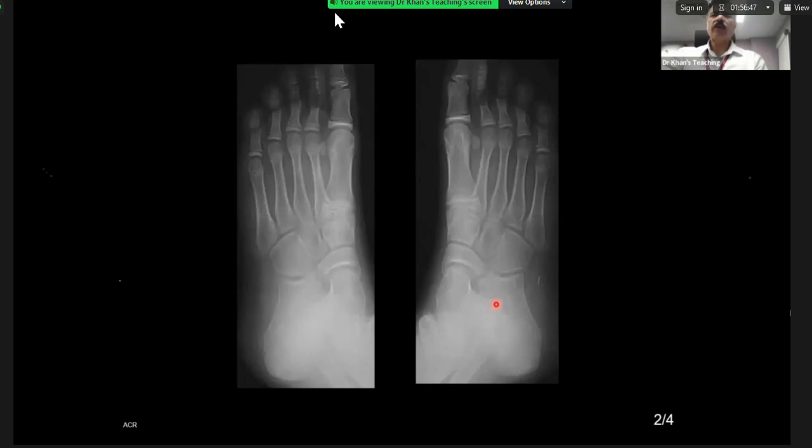But you will not find a bony bar. MR is considered very sensitive there. In many cases, CT, some people think, might be a savior. Having said that, usually in an FRCR exam, they go for plain films.